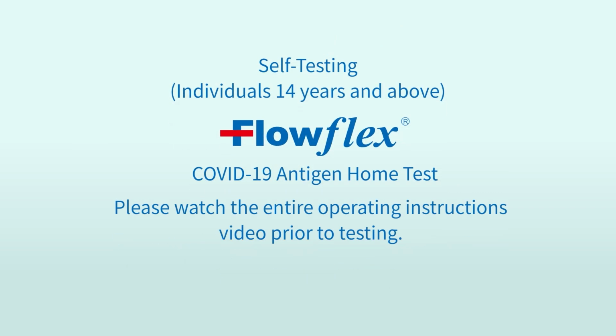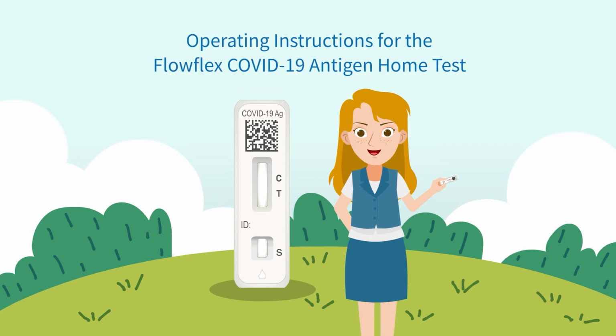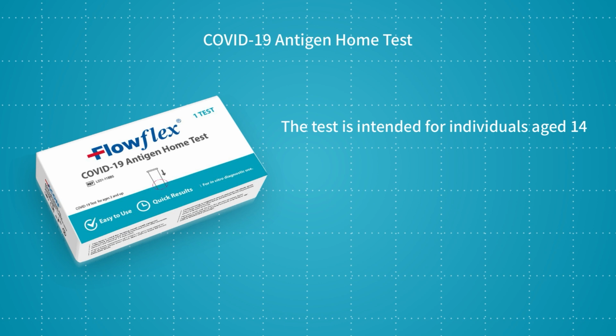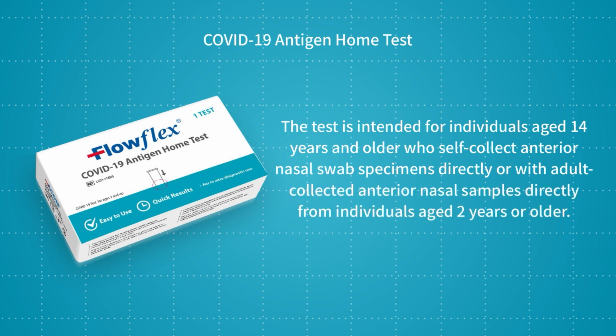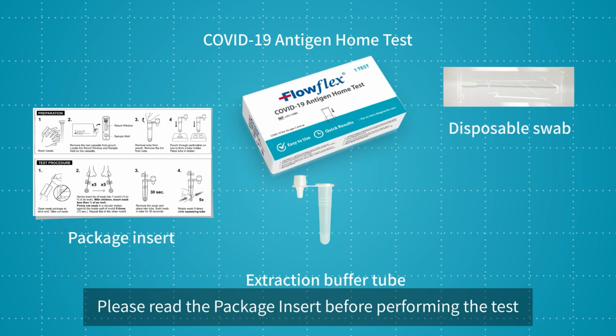Please watch the entire operating instructions video prior to testing. The test is intended for individuals age 14 years and older who self-collect anterior nasal swab specimens directly or with adult-collected anterior nasal samples directly from individuals aged 2 years or older. Please read the package insert before performing the test.